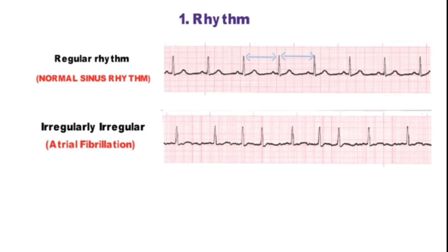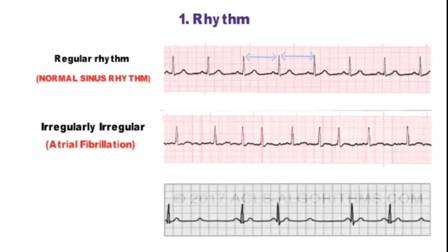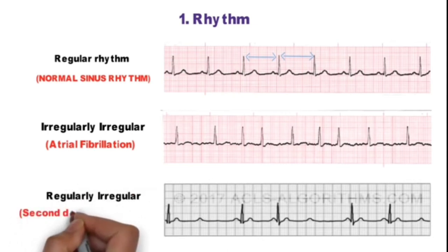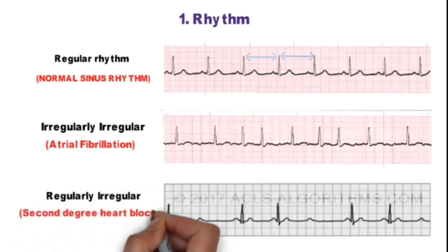Now look at this ECG - normal regular rate with regular drop beat. So rhythm is regularly irregular, which is seen most commonly in second degree heart block type 2.